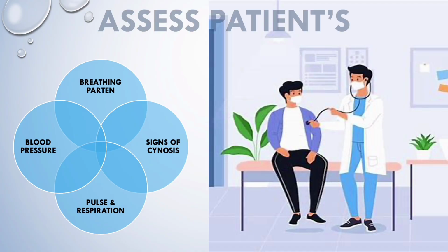Do not forget to assess the patient's condition. Check the breathing pattern. Check the signs of cyanosis on the patient. Check the vital signs, which include pulse, respiration, and blood pressure, as this may determine the oxygen in the blood of the patient.